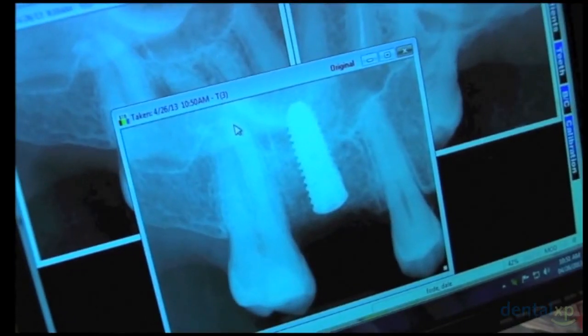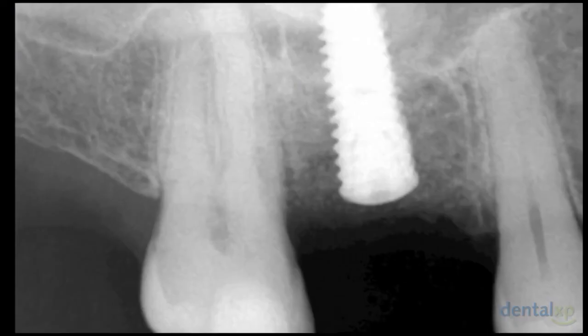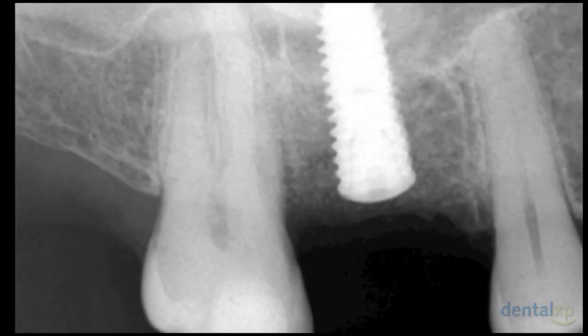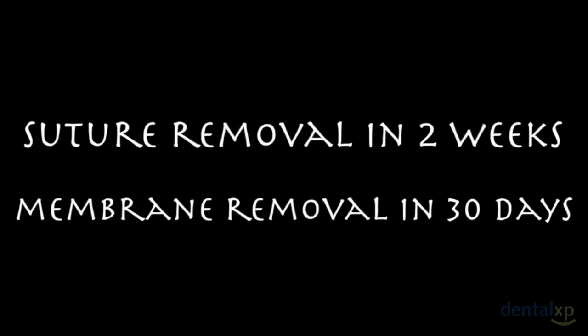Here you can see the implant. It raises the sinus about three millimeters, and the top of the implant is about two millimeters deeper than the interproximal height of the crest of the bone at the distal of the premolar. Sutures come out in two weeks, membrane in 30 days.